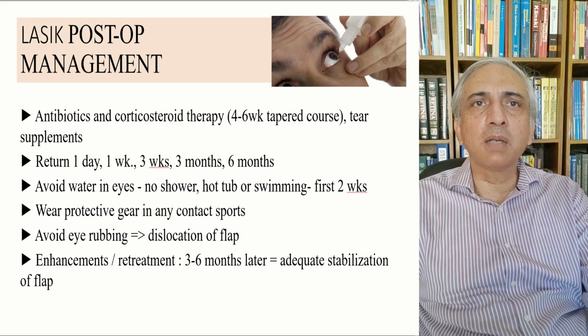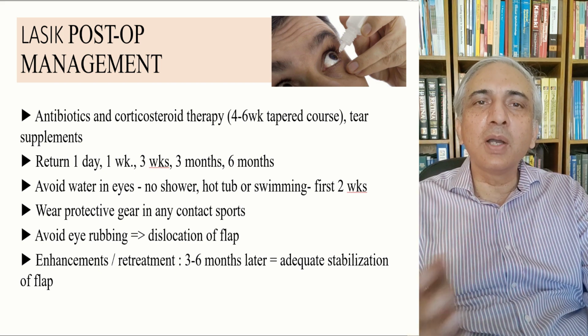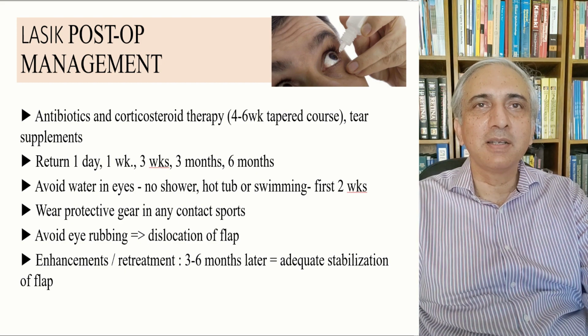Enhancement, retreatment can be done 3 to 6 months later after adequate stabilization of the flap. Actually, you can go and re-lift the flap when you do the surgery. That is the exciting part of it.